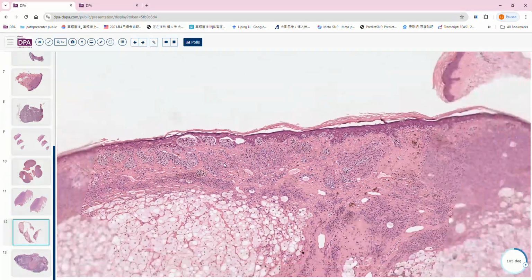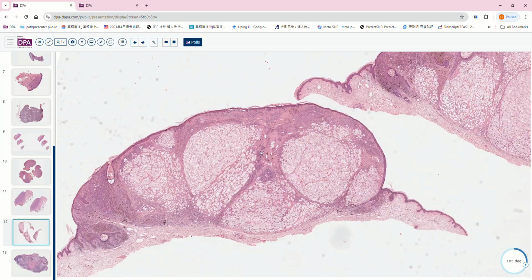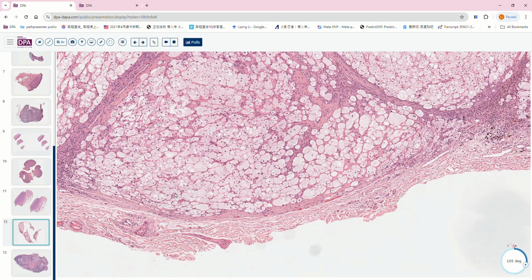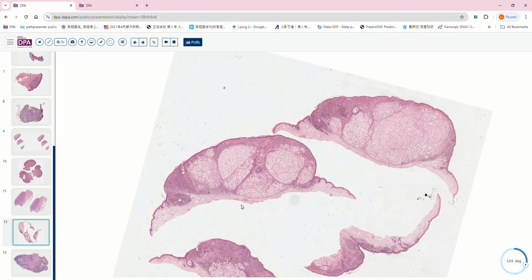There is a more convincing finding that this part is coming from this conventional melanoma in situ and then going down. And for maturation, you can see that these cells still form nests, even when they go really deep down. They do not become sparse melanocytes, so they lose maturation. So we combine all of these features: asymmetry, melanoma in situ, and not maturing when the melanocytes go down. So this is a balloon cell melanoma.